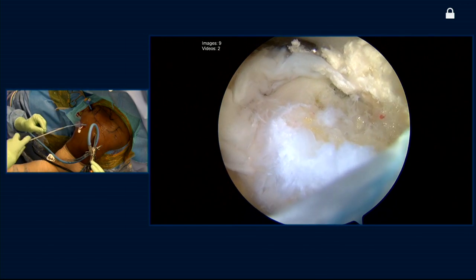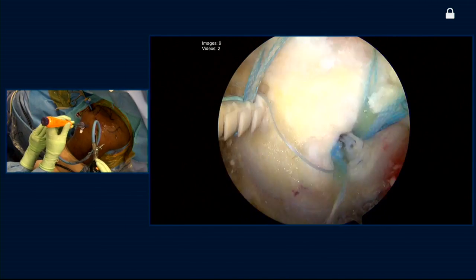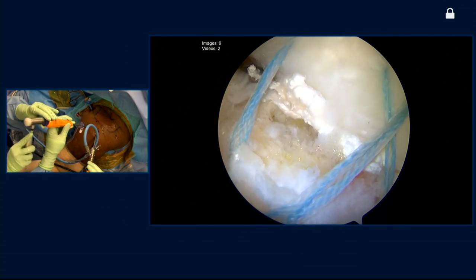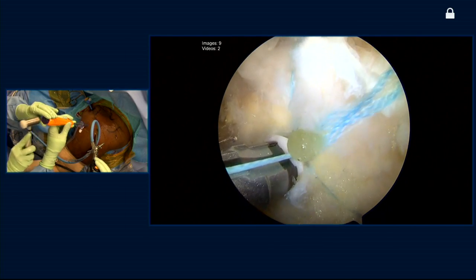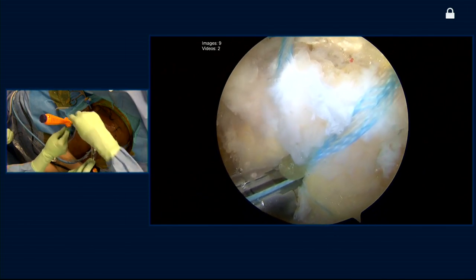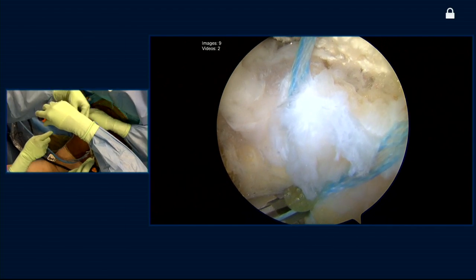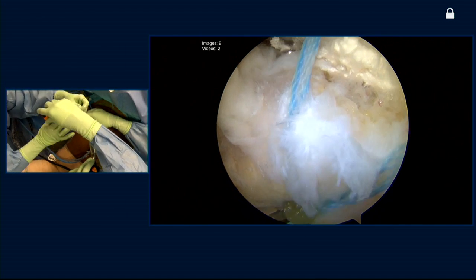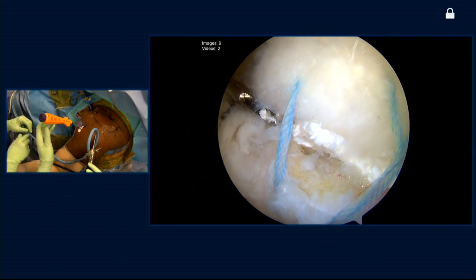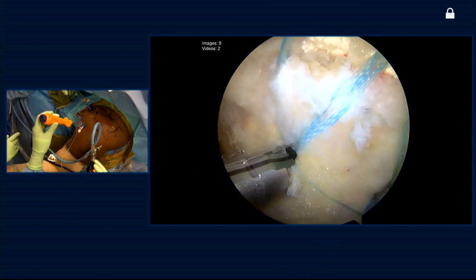We've got this loaded into our second lateral row anchor. Got a little tension on it as we slide it down. Nick, you're using these tapes — do you like that better than just regular sutures? I do. There are a couple of advantages: number one is they're obviously stronger. Number two is because they're wider, they distribute load across the tendon and improve the contact area between the tendon and the bone. And number three, because they are wider, some of the fixation we get laterally is based on an interference fit — the tapes certainly help us achieve an interference fit between the lateral row anchor and the tape to prevent slippage.